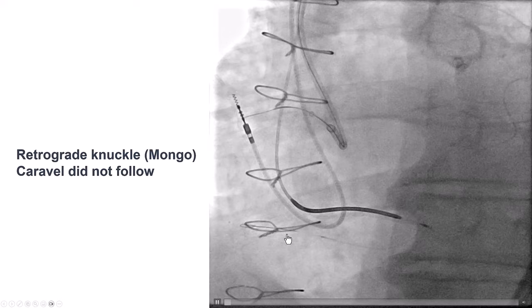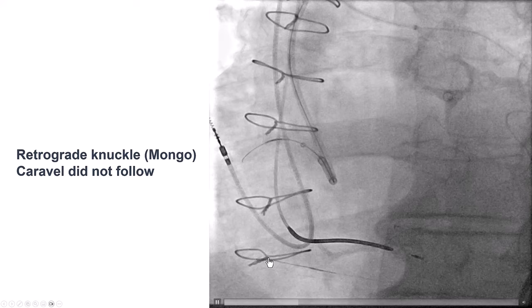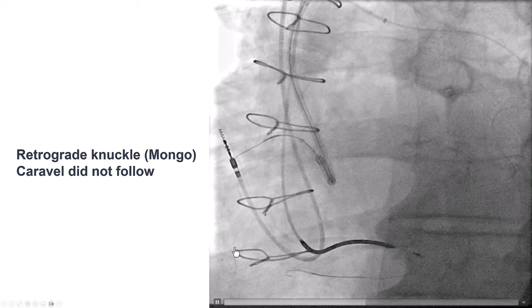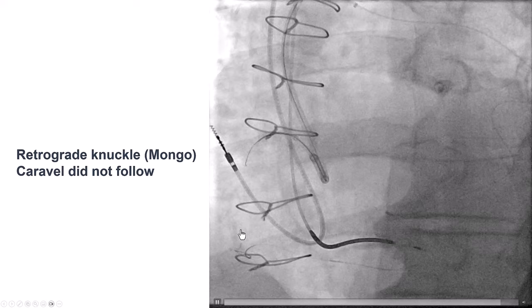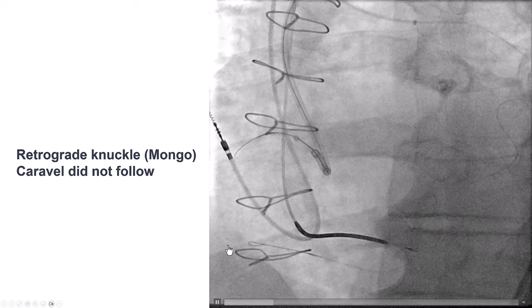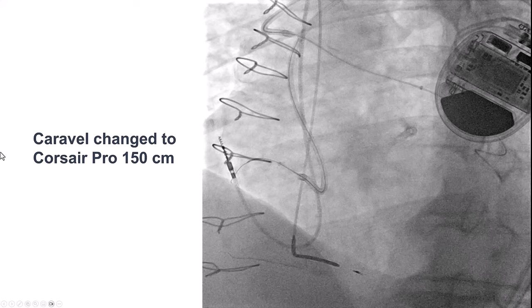We did try to knuckle a Mongo wire retrogradely. However, the Caravel microcatheter could not follow distally — the Caravel is not a very supportive microcatheter. There is a lot of calcium and tortuosity, which makes it hard to advance the knuckle further up into the distal and mid-RCA. So we decided to change the microcatheter and inserted a Corsair Pro 150 centimeters.